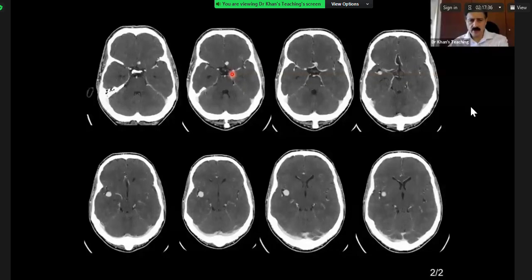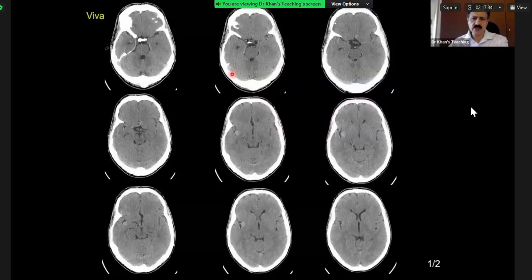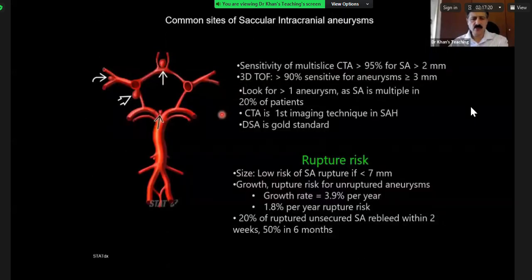Okay. Please remember, these kinds of cases come in the exam very, very commonly. This is what I call an observation case. Pick up a finding, ask, and find. Now, you have to understand this bit to be able to go back.